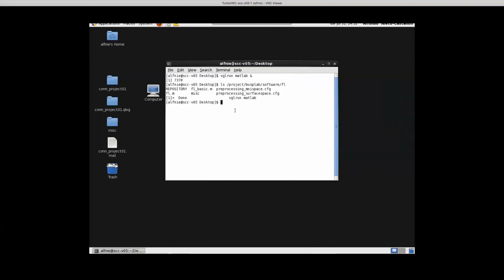You made an argument when I had asked you, well, why wouldn't you always do direct normalization? And you said, when you don't have a good field map. Yeah, exactly. So then you'd use direct. It seems like we're going to want to do surface space analysis most times, but you're going to want to do one of those other two, and it sort of depends on what you have. So I would say if you have 3 of these example config files, that would be helpful.